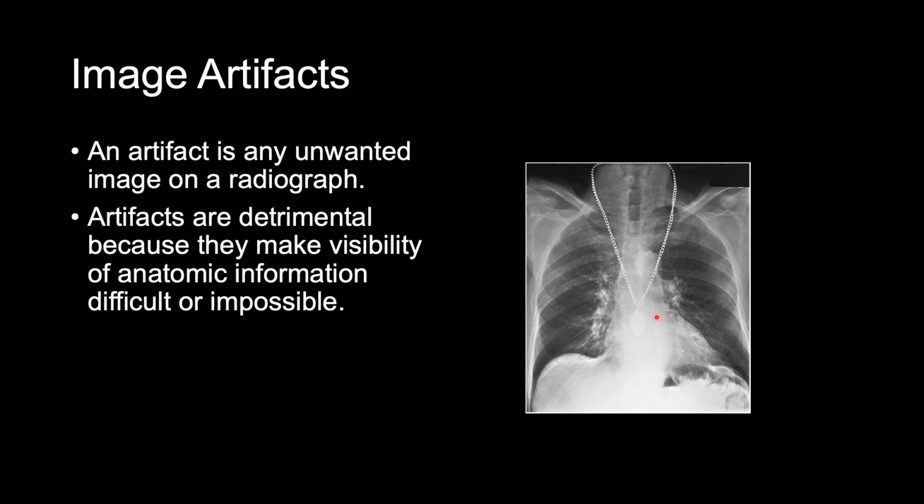So artifacts are detrimental because they are going to make anatomic information difficult or impossible to see, and there could be pathology hiding behind that. Always make sure when you're doing any kind of x-ray that you get any artifacts out of the way. So necklaces on a chest x-ray, bracelets on a wrist x-ray, earrings for skull and spine x-rays. Make sure you're always having your patients take off any unwanted artifacts.